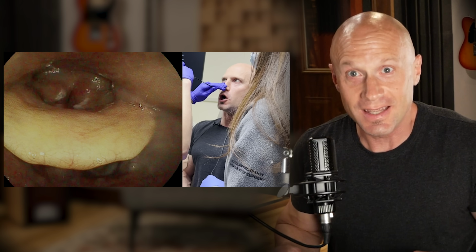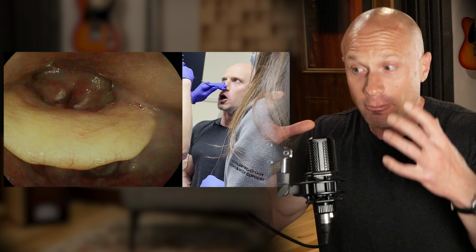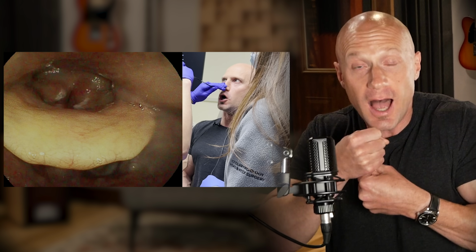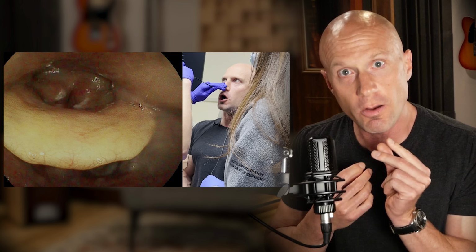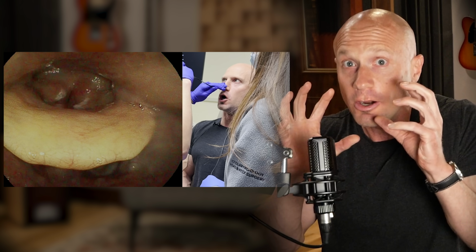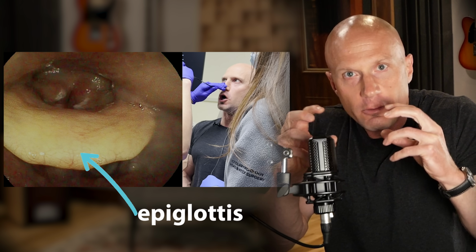Now here you can see the saliva and mucus and all the fluid that's in there vibrating and rattling along with this intense upper constriction. Yes, upper, it's higher. You can't see the false cords. You can't see the primary cords anymore. The air is passing through this narrow opening caused by this apparent enlargement and encroaching role of the arytenoids. So we could call that an arytenoid rattle with false cord engagement, right?